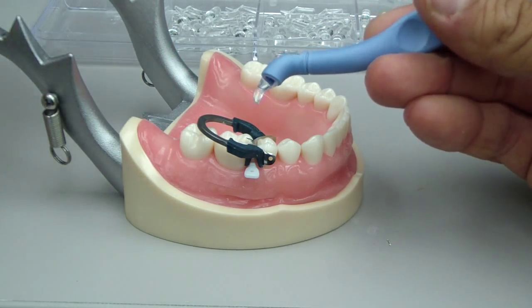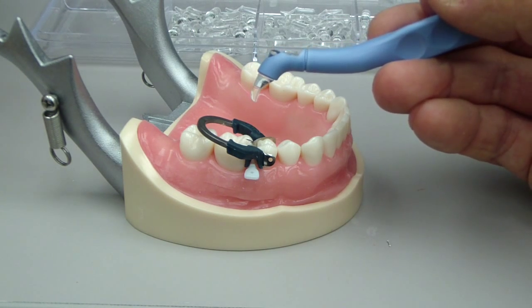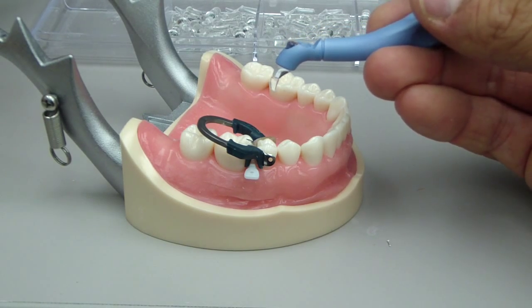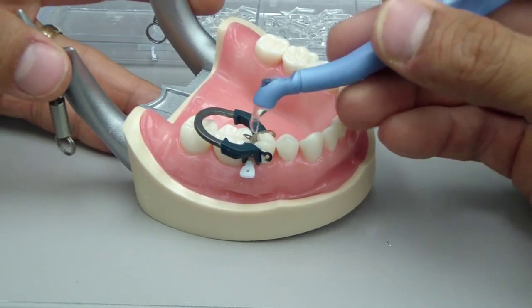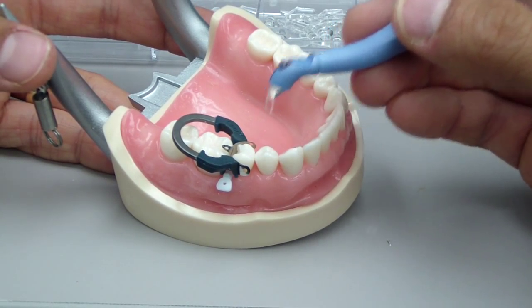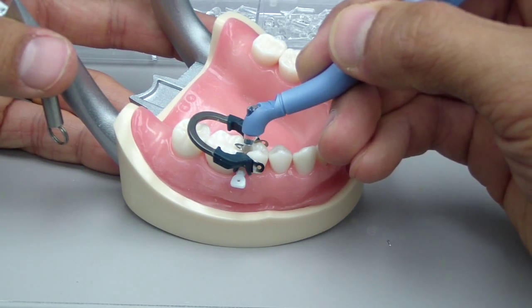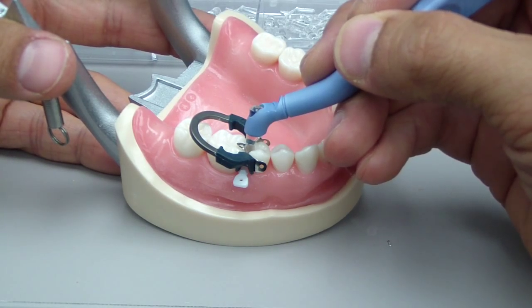This instrument is touted — and I'm not going to talk about what brand because I think they're all similar — but it suggests, and I think it's fairly helpful, and there's not a huge amount of literature. This is a PaloDent ring system for placing class 2 composites and amalgams as well.